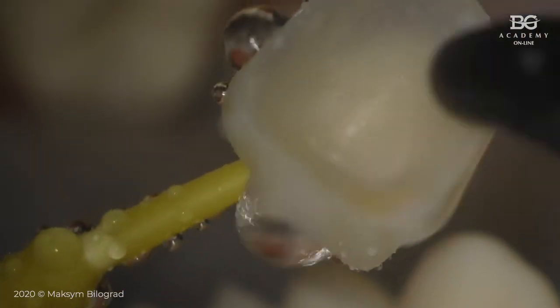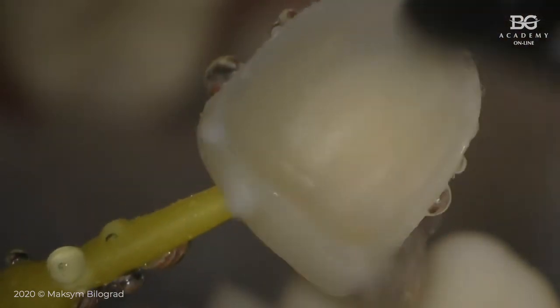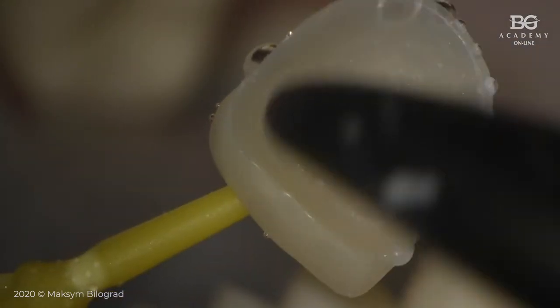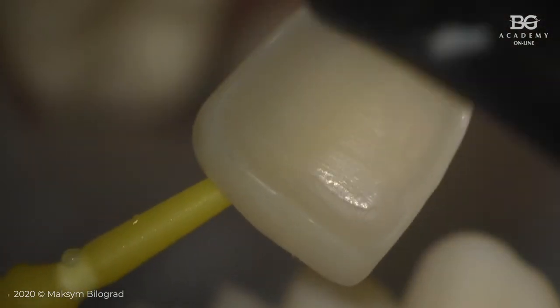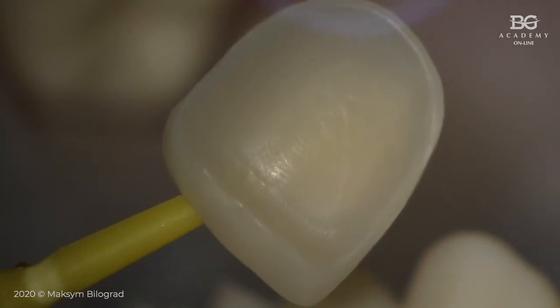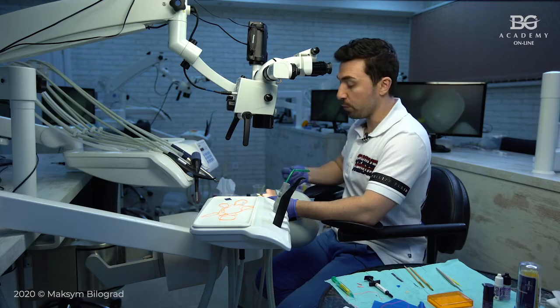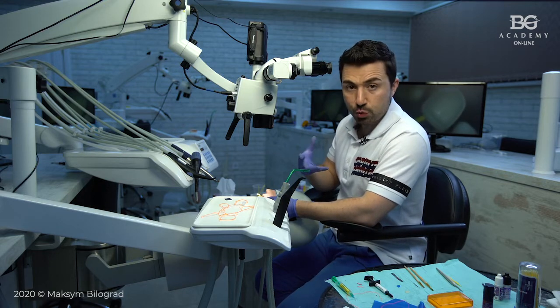We have to rinse it very precisely. A lot of rinsing. Okay, good. Then you will dry. And then sometimes if you over-etch the ceramic surface, you may get some dusty interface, which is salt. There is really like a white powder on the ceramic surface, which is salt, and you have to remove the salt. Otherwise, your process of silanization will not be efficient.